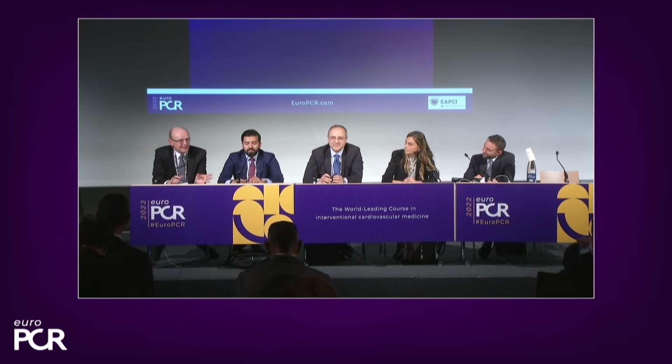And the drug element protects you in 3 months' time. So this is a non-compliant balloon deployed carefully with scrupulous assessment of the angiographic result. There's no magic in the paclitaxel or the sirolimus that makes a difference to whether that vessel is going to stay open at 1 hour or 12 hours or 24 hours. So it's going back to using balloon angioplasty essentially in the skills that we had then.